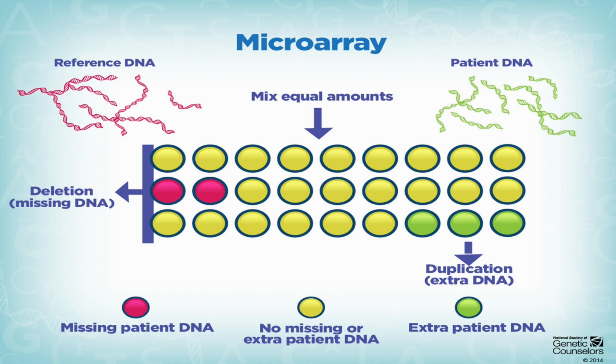in the genome. Microarray technology excels at detecting genetic changes too small for traditional karyotyping, which has a detection limit of 5 to 7 million base pairs. For example, 22q11.2 deletion syndrome involves a 1.5 to 3 megabase deletion on chromosome 22, and Prader-Willi or Angelman syndrome involves 4 to 6 megabase deletions on chromosome 15. Both are changes that require microarray analysis for accurate identification.